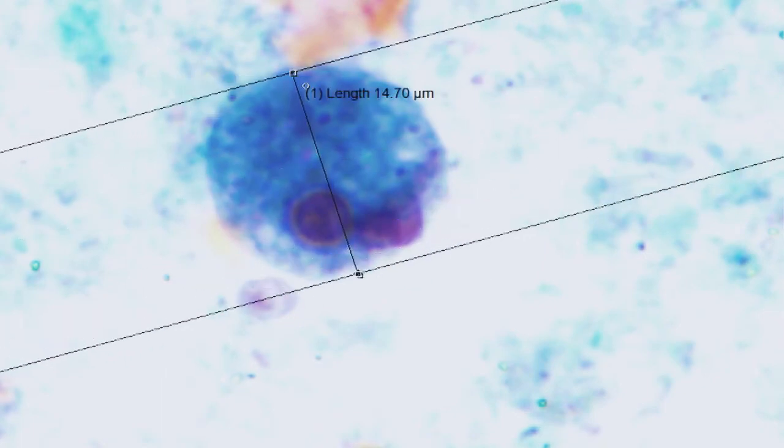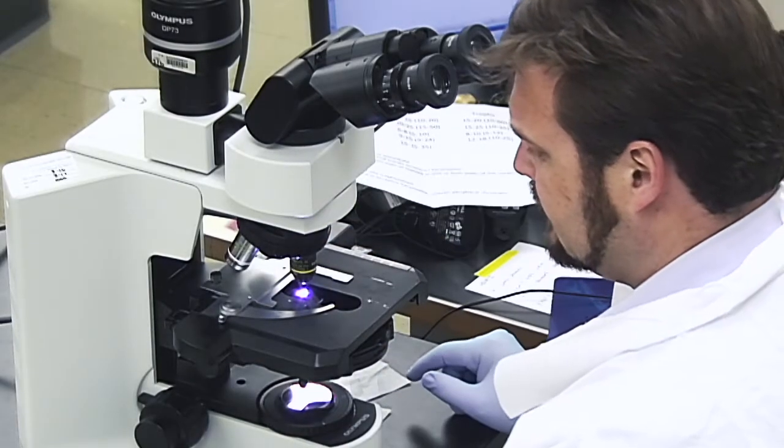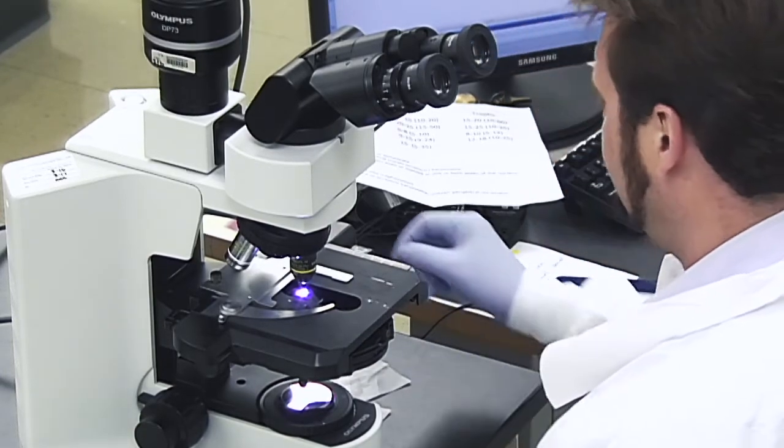I'm just going to turn up the light a little bit for you, and I will also zoom in to some degree. Very eccentric karyosome. And you can see there's sort of a bumpiness to the peripheral chromatin, although it's quite even. But look in here, see these bacteria? 1, 2, 3, all these ingested bacteria tell me this is E. coli. And if I measure it, it's 15 micrometers. That's within the normal range for E. coli. So those are trophozoites of Entamoeba coli, quite different to those of histolytica, particularly in that nuclear morphology.